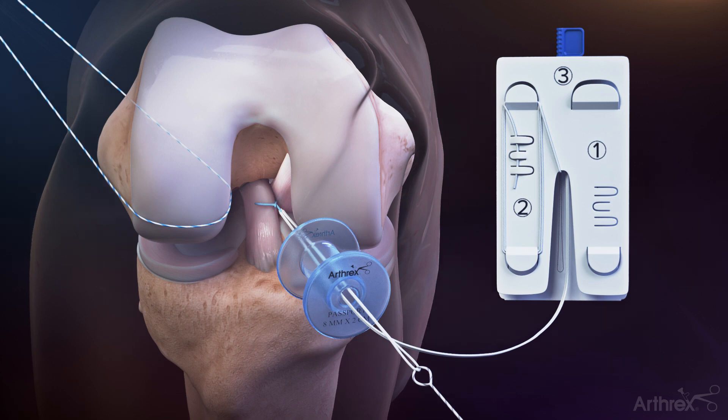Discard the fiber ring shuttle suture. Repeat this passing step to load the tightrope suture onto subsequent fiber ring sutures for additional luggage tag stitches.